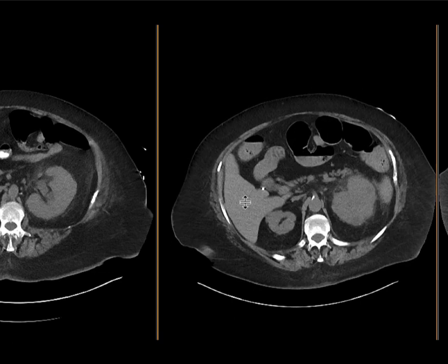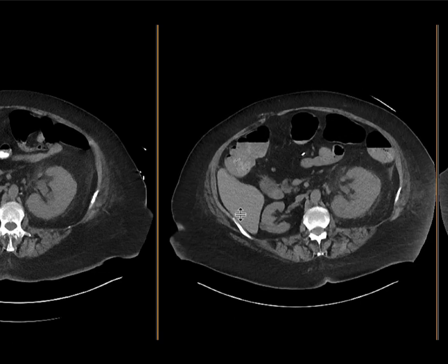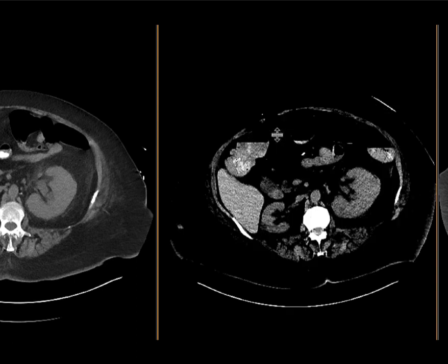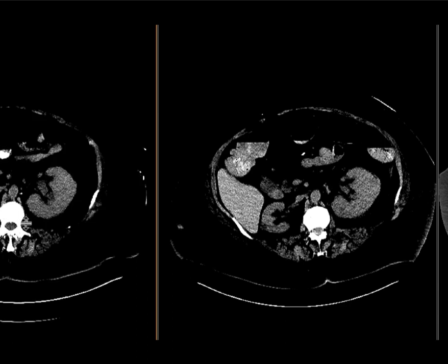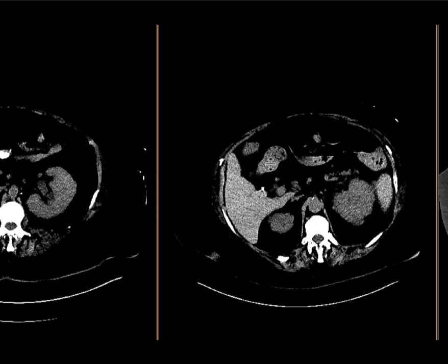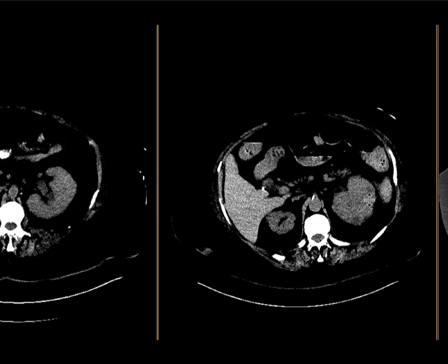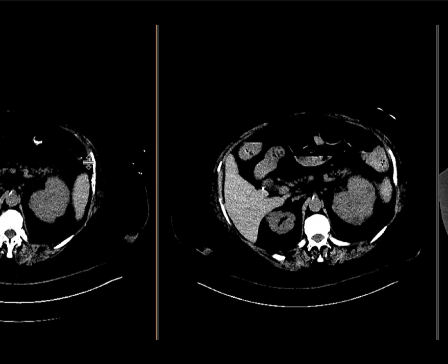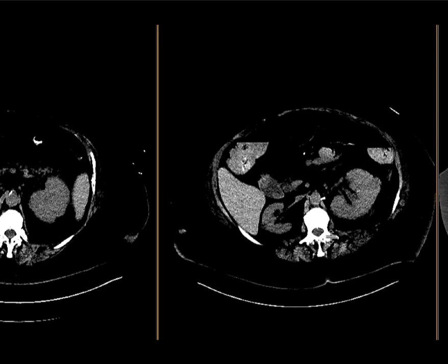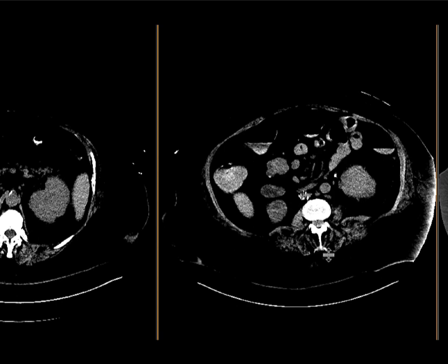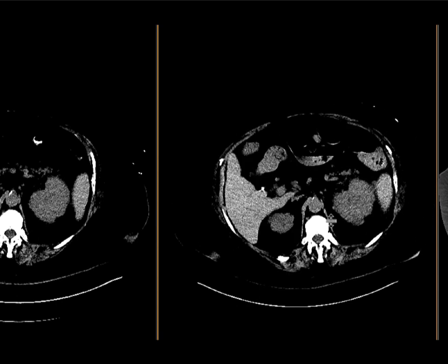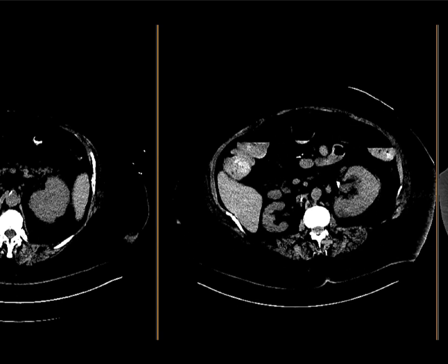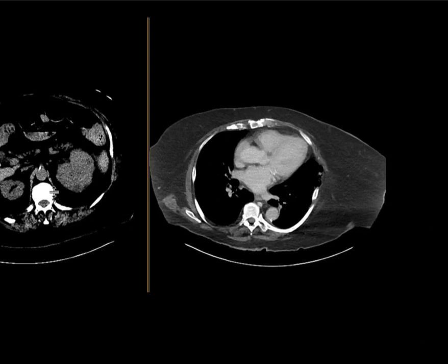However, the left kidney looks persistently abnormal — it is asymmetrically enlarged and some of the fat stranding looks a little worse. When windowed, there's interval development of a few low-density areas within the left kidney. Some may have been present in retrospect on the prior exam, but they've gotten bigger and other regions look new. These findings are concerning for pyelonephritis with superimposed abscesses and phlegmons.